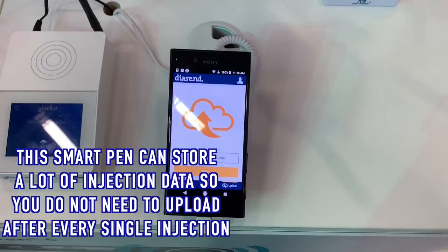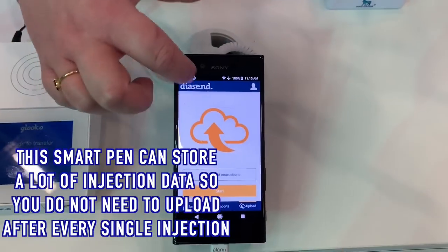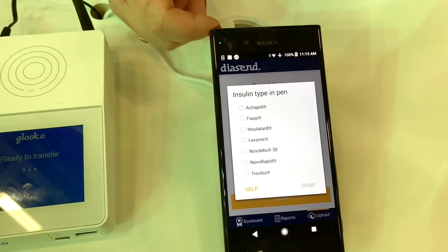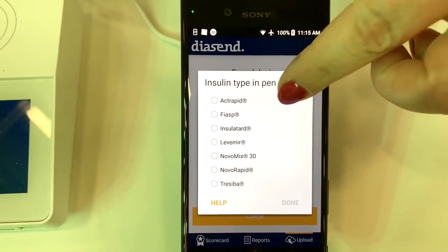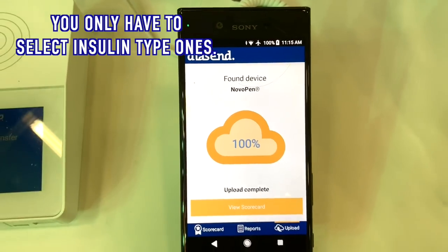Yep, on the pen. And then you put it. This is NFC, so in this phone, the NFC sits. So you just put the pen on the phone, and then the upload starts. Oh my god. And then the pen doesn't know which kind of insulin is inside, so you need to choose that. So let's say it was kind of a Tresiba. Yep. And then you're done.